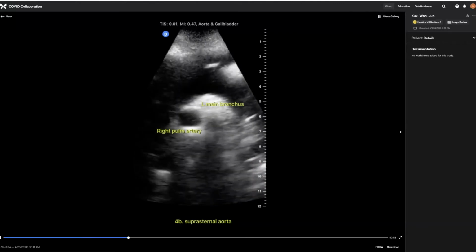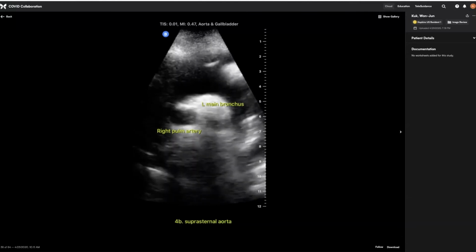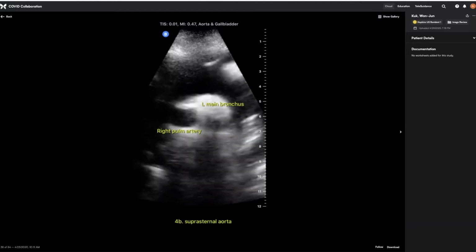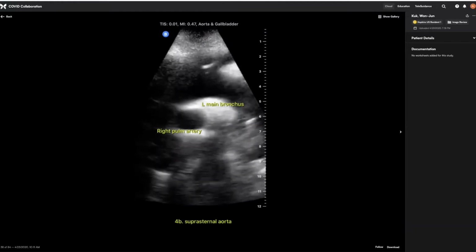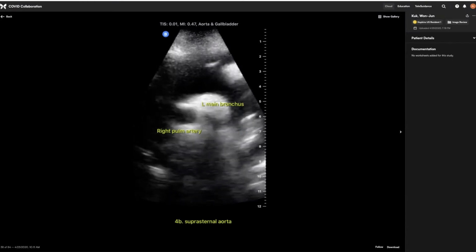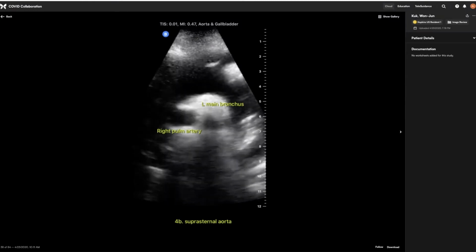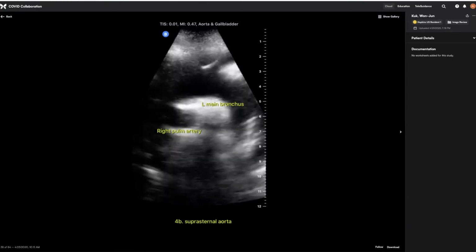Yeah, that's not only a great image acquisition, but there's very little as complex anatomically as the base of the heart and the origin and branching of the great vessels. And if you're just getting a 2D slice to have a sense of what's pulmonary artery, what's lung component, what's arch, that's really quite a great comprehension of what they're looking at there, and a really nice image.